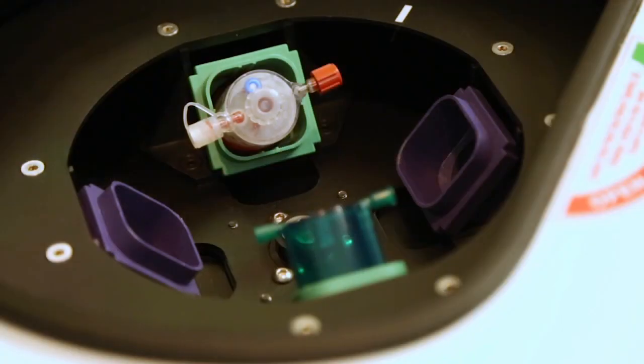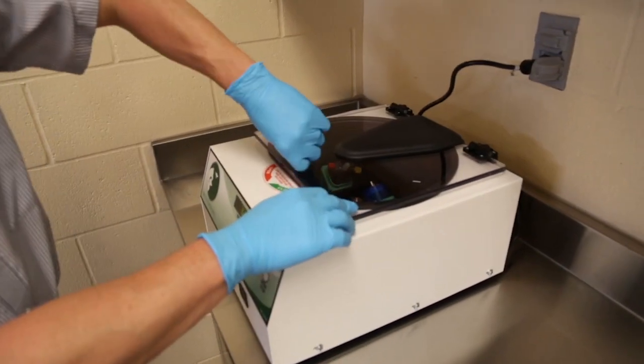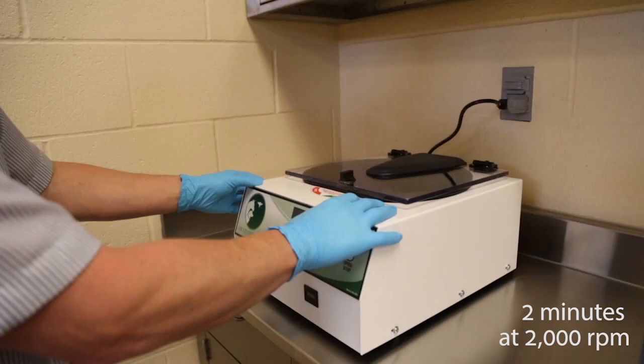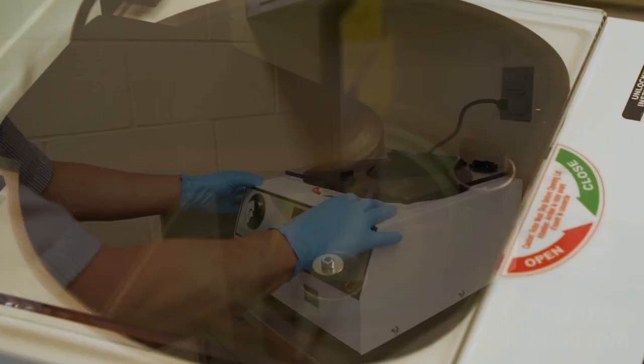Alternatively, if a second ProStride kit is being used, this will serve as the appropriate balance. And again, the green centrifuge buckets must be used with ProStride. As done before, close the lid and secure the latch on top of the centrifuge. Set the RPMs to 2,000 and time to 2 minutes and push the start button.